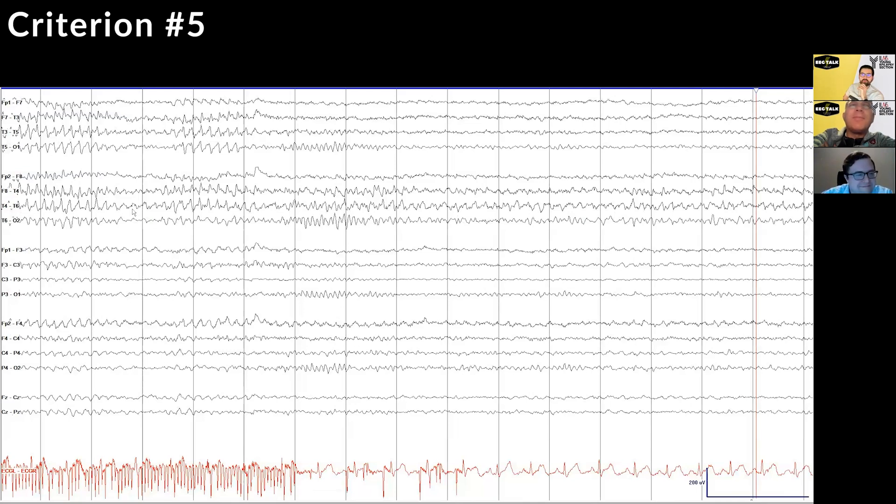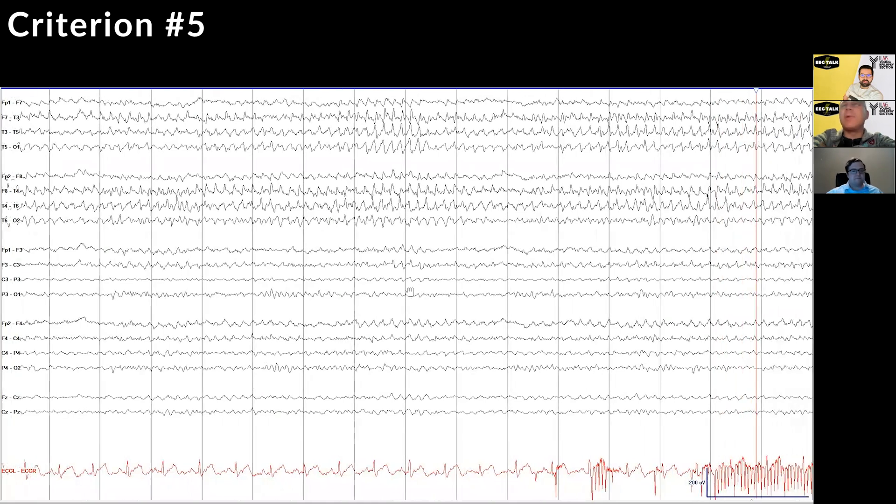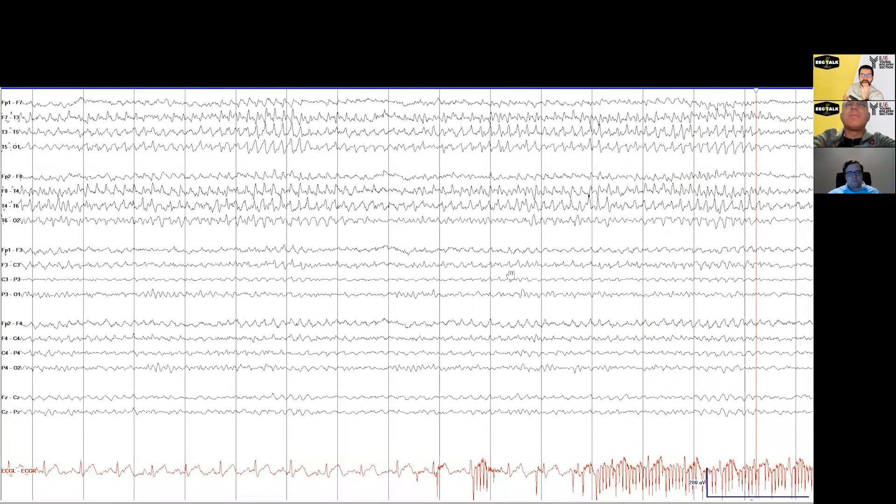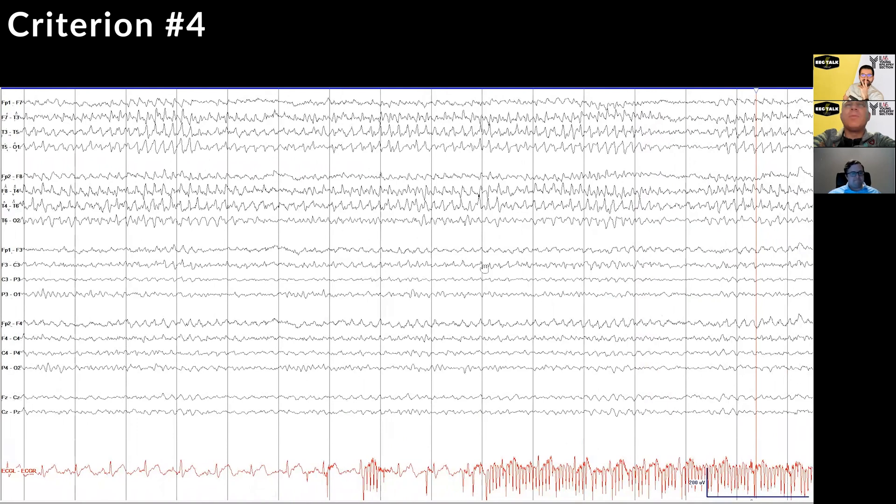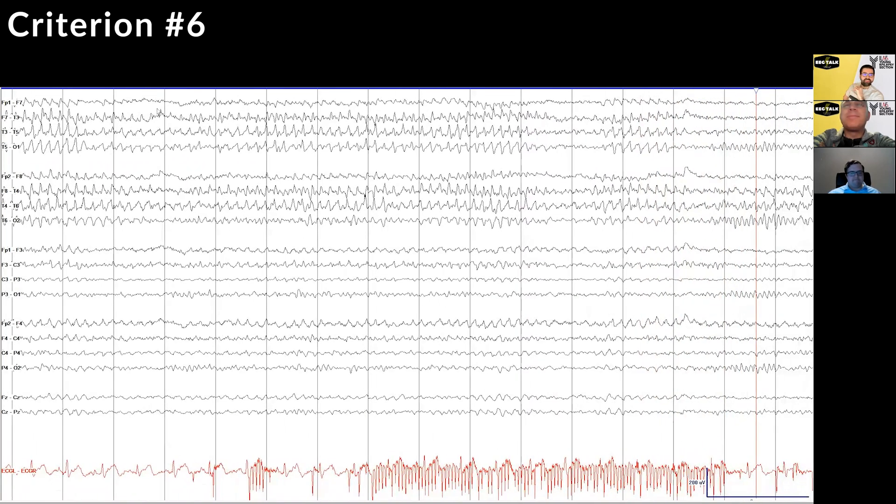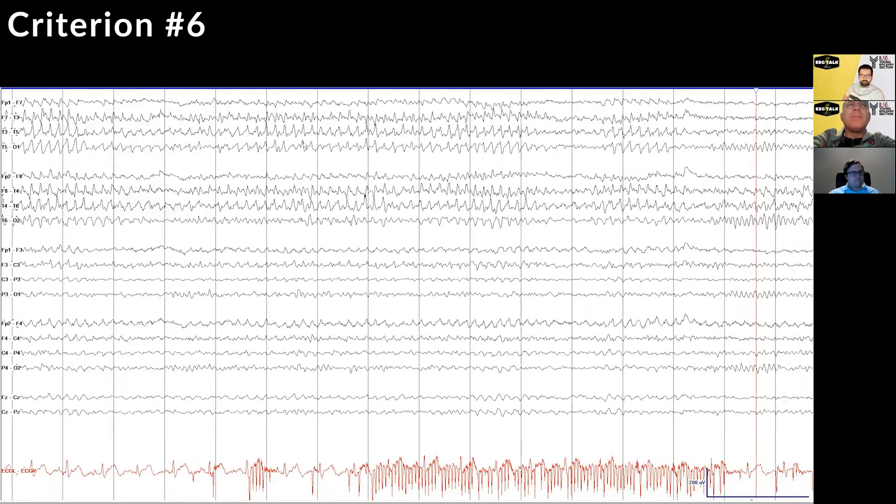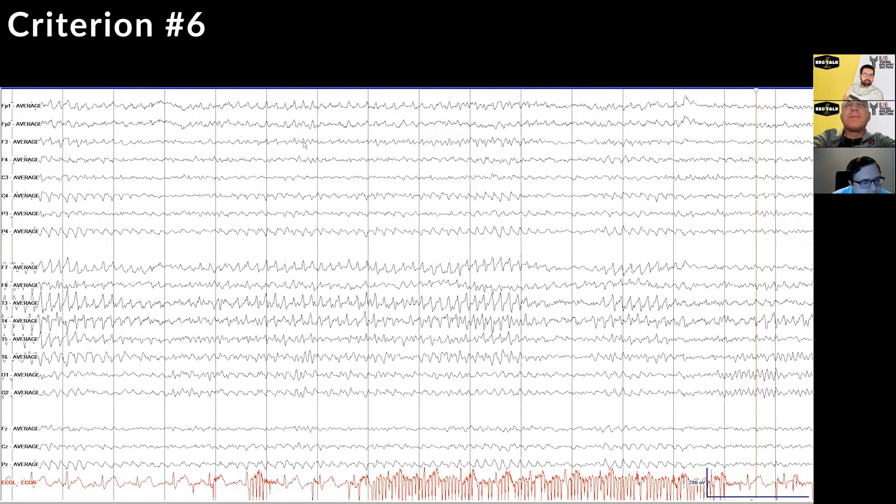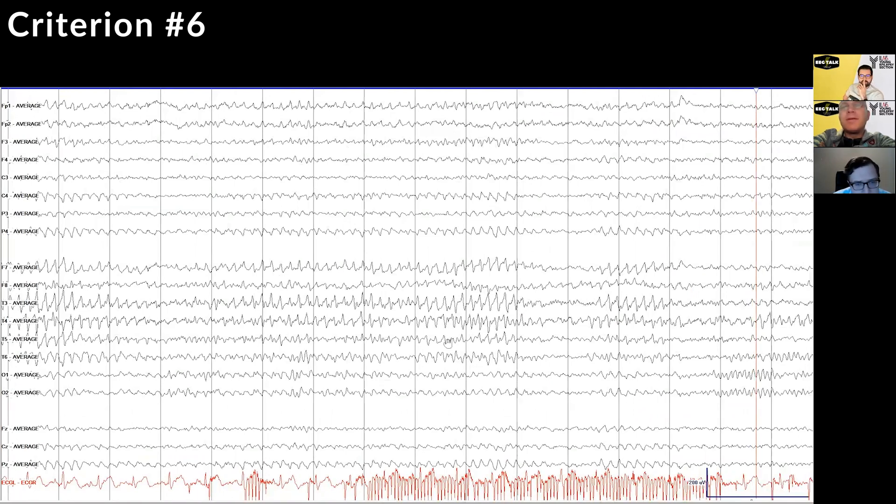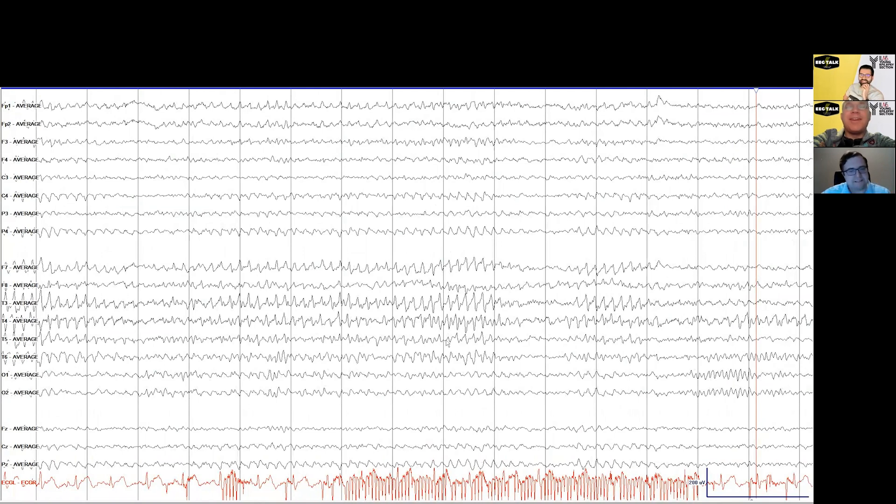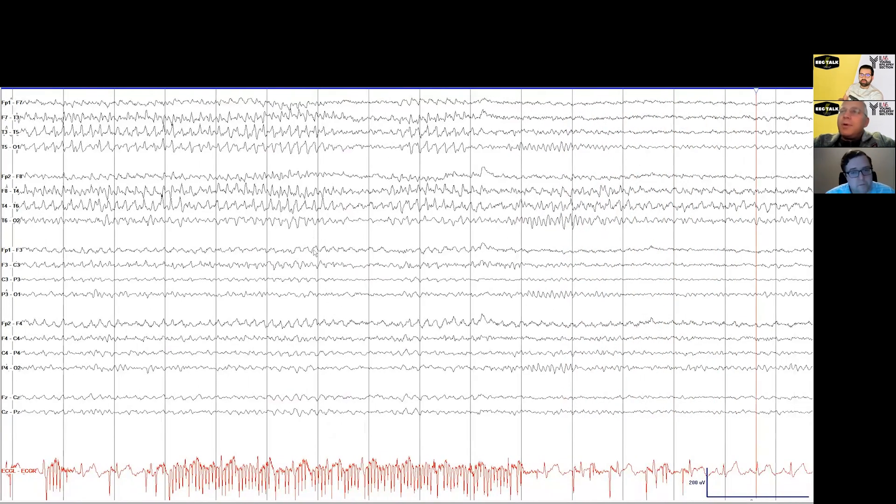Okay, so any of the waves individually are truly asymmetric, or if they're just adding up to be asymmetric looking? It stands out. This doesn't stand out. Yeah, because it's got too many friends nearby. Yeah. Okay, and aftergoing slow wave? No. In field? Probably yes. Switch to average. Yeah, it has a field. Yeah, okay. So we have spiky field, that's it, right? Just two, then two out of four. Yeah, all right. I guess that's true, not making it. Cool. Good, it's normal.